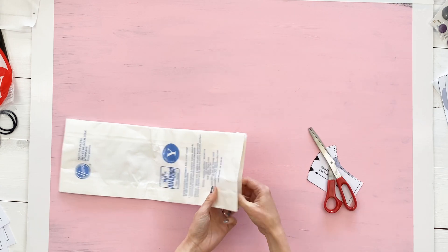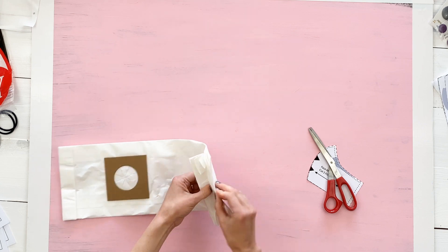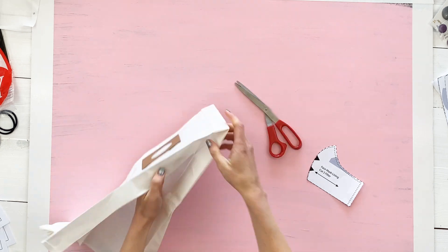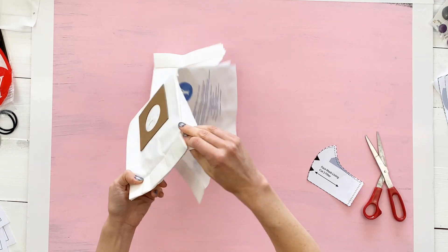I like to trim it across the top so that you can open it wide, and then open it again at the bottom so you have one solid sheet of fabric. This is going to give you the most bang for your buck and you'll have the most usable space to work with.